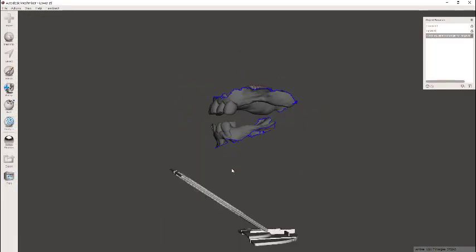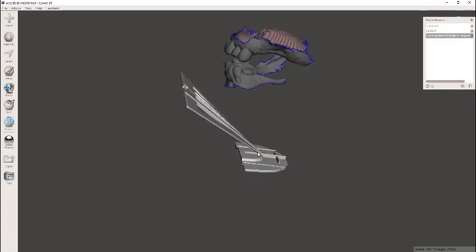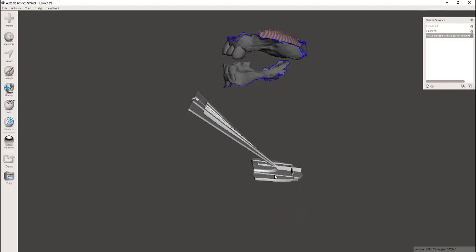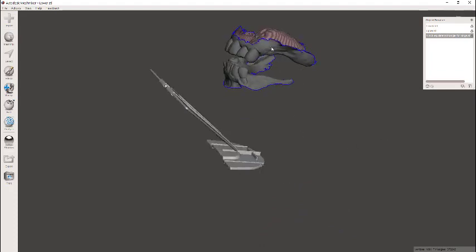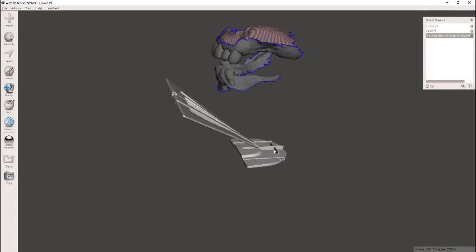And here you see that I now have all three files in. Now, in my first example, I actually showed aligning the models to this, but you can also do it the other way. So for this example, I've already got these models stitched in Blue Sky where I want them. And if I go now aligning them to this, then that throws all of that off. So instead, what I'm going to do is align the Bonwill triangle to the models.